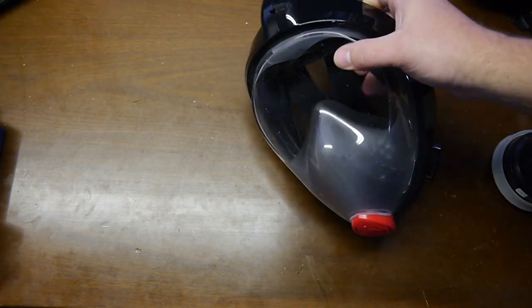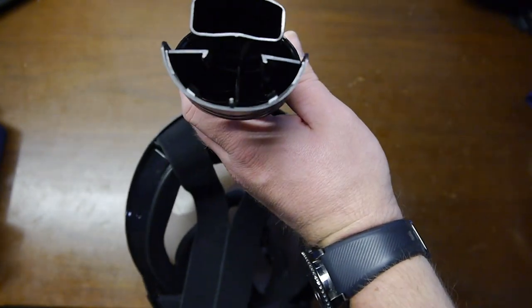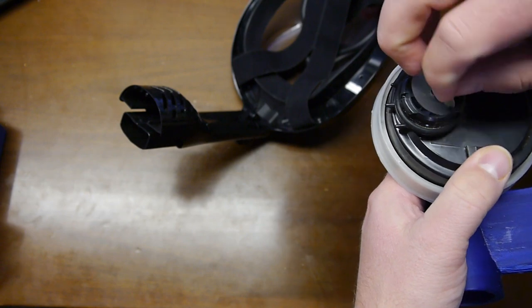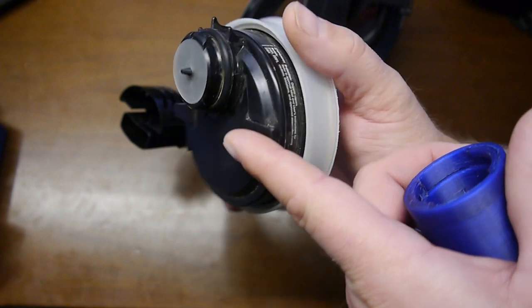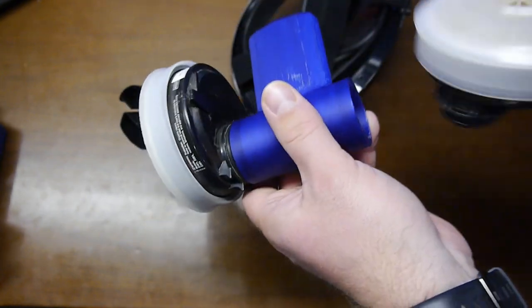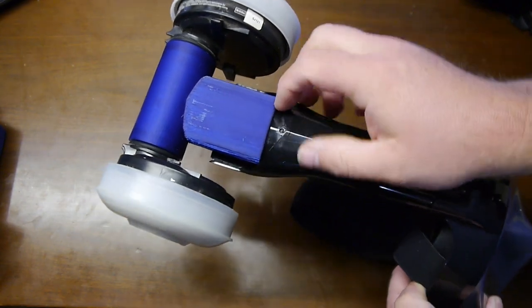What I came up with was this. So this is your typical snorkeling mask. I removed the valve assembly up top here. It has a cross section that looks roughly like this. This is where the breathing air goes in. So I made this adapter here. I have these filter cartridges left over from my other experiment, and it has, I don't know if you can see that, but essentially it has these tabs 180 degrees rotated apart, so these slide in like so, and then the whole assembly slides over like that. And then a little bit of silicone here just to make sure.